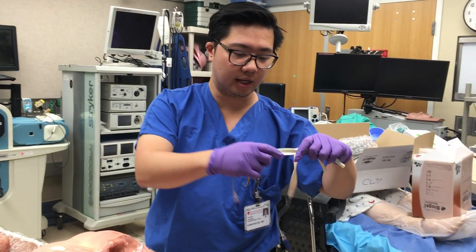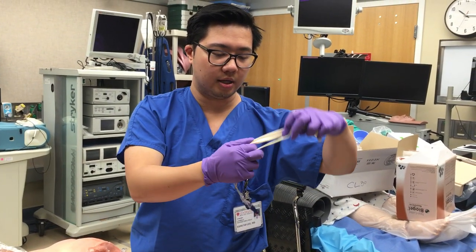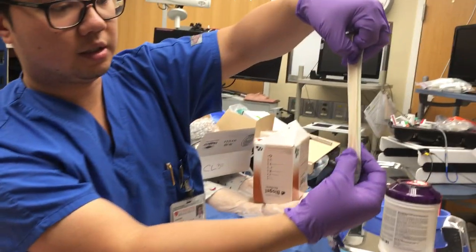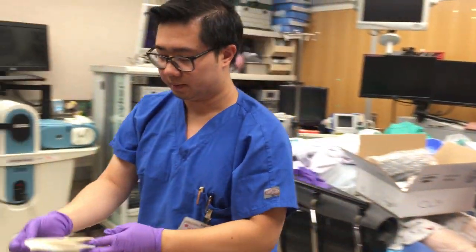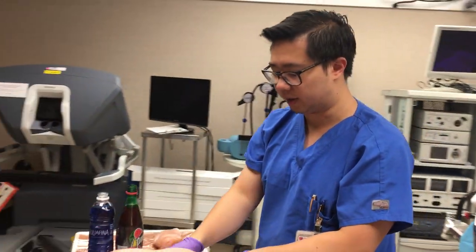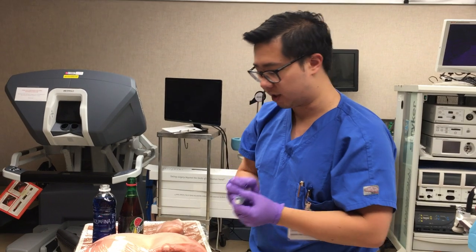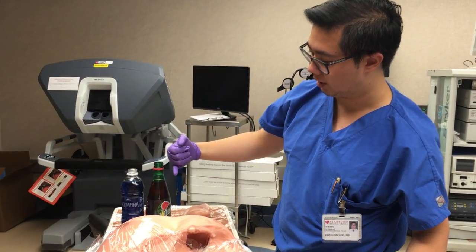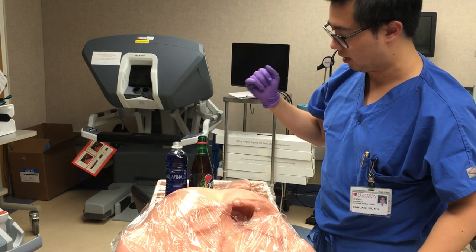For the veins, you can see that the diameter is larger than the arteries. If you look right here, it's very clear. We have a spike to go through the chicken breast, a 20cc syringe, and we have water with food coloring — blue and red — for artery and vein.